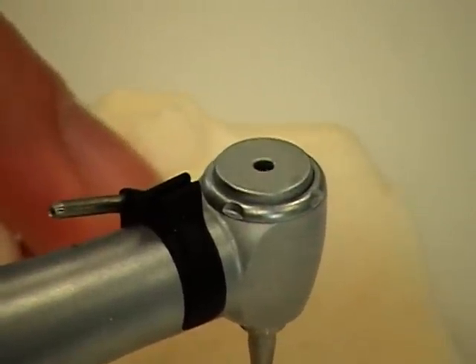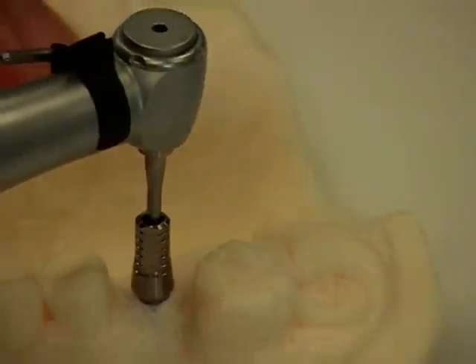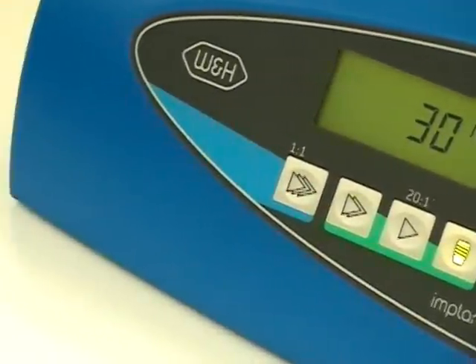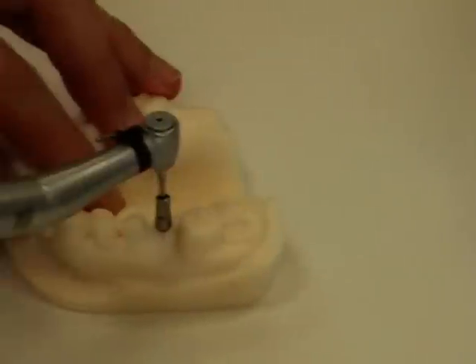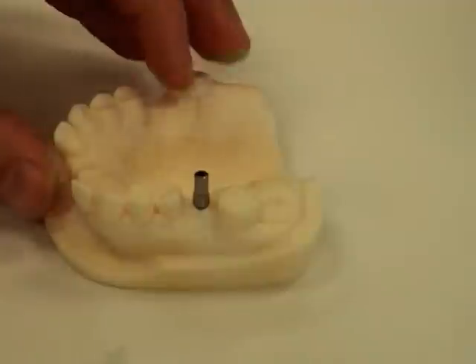It turns very slowly — you can feel it — and then you feel that it has stopped. It's no longer needed to tighten; you can remove it. If you attempt to insert it more, once again it will beep and tell you that it's at the correct torque. Remove the driver, and you're finished.